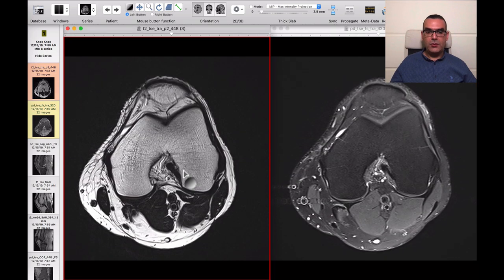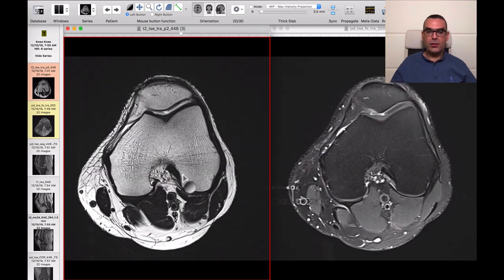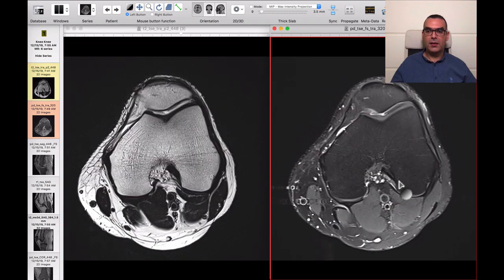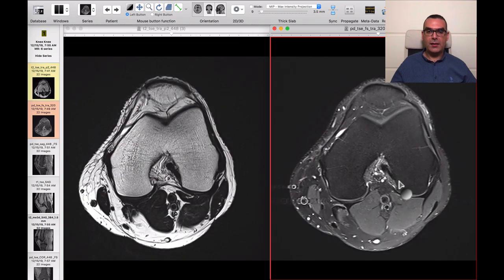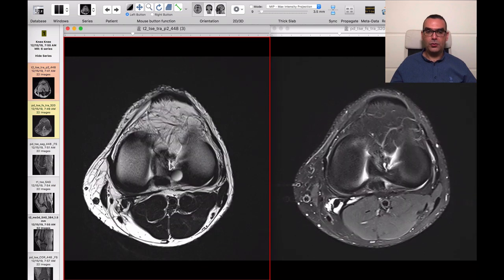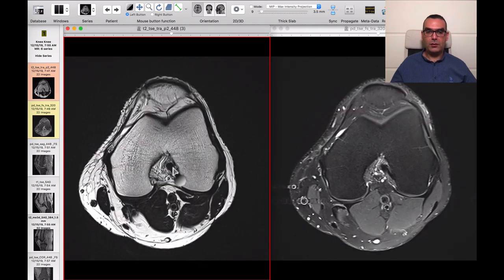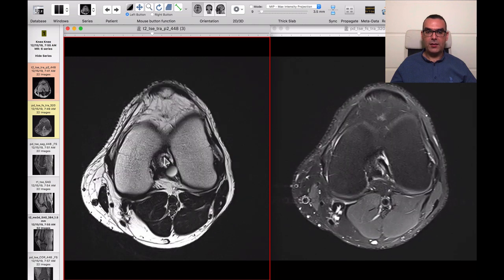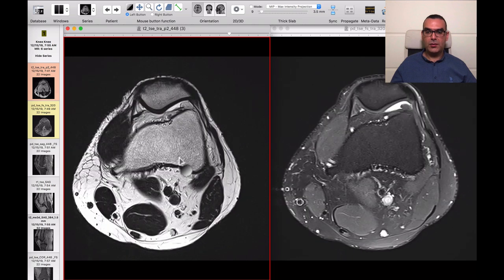As we said before, always examine the ACL femoral attachment — make sure it's homogeneously hypointense with no fluid signal within or surrounding it. The ACL attachment is apparently intact, and continuing with the rest of the ACL fibers down to the tibial attachment in the axial, it also looks good.